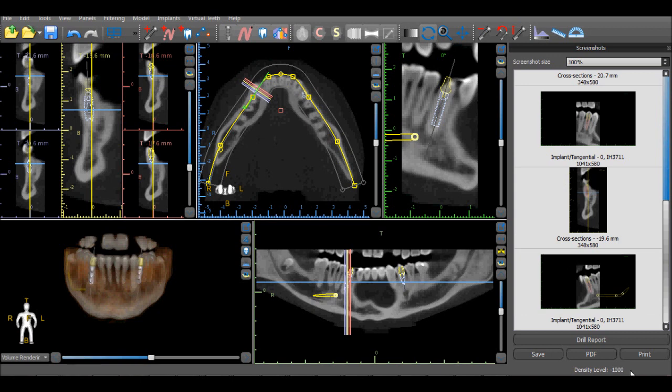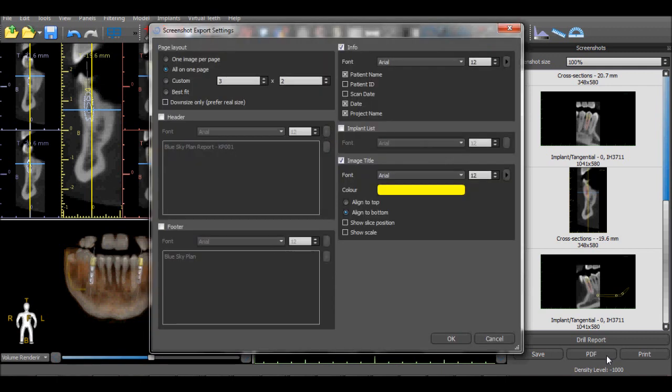The PDF and Print options allow the images to be turned into a PDF document or printed from your printer. When these options are selected, an options dialog box appears on the screen.